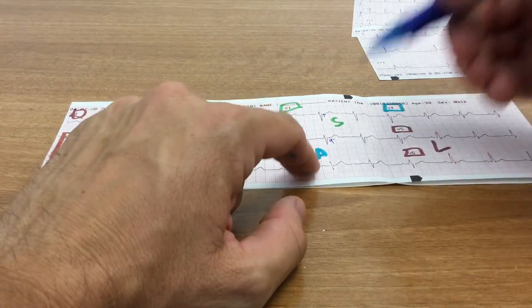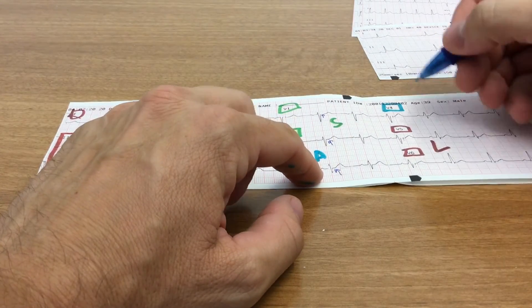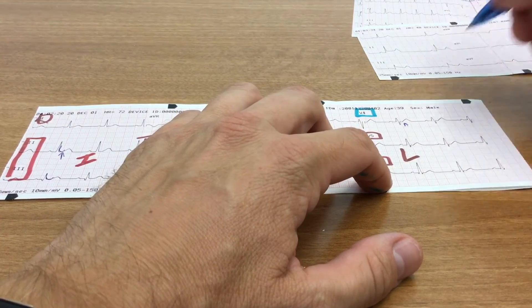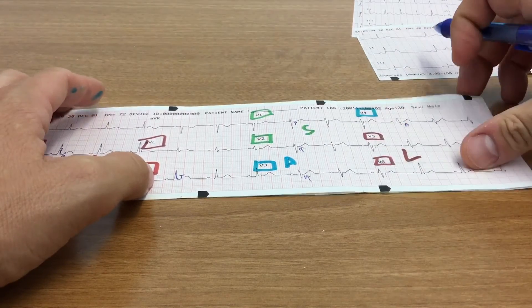Move over to anterior. I have a return to baseline there at the J point. Okay, and V3, V4. I also have a return to baseline there as well. So my septal and anterior walls check out.